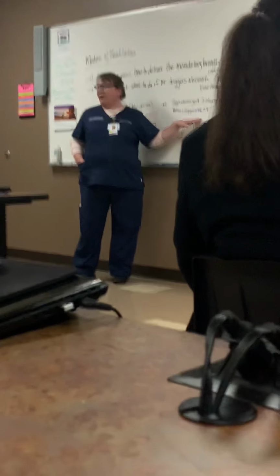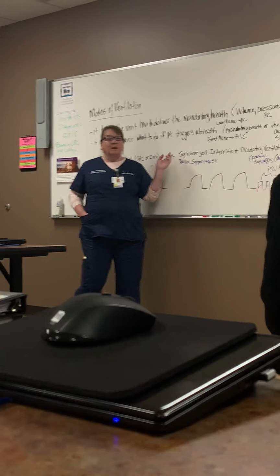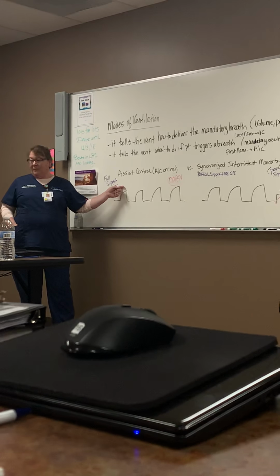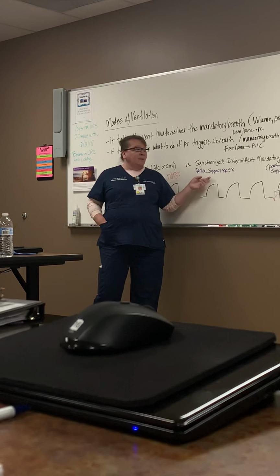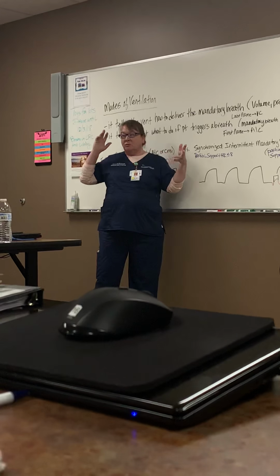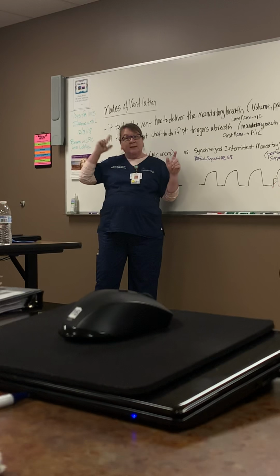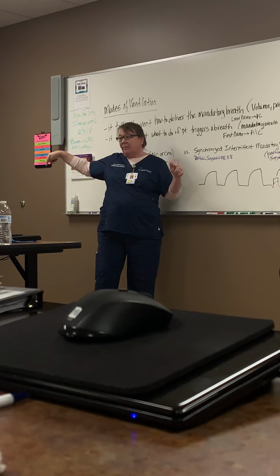We're really moving away from SIMV, and there's a couple reasons. Number one, we have found that we can go right from assist control to weaning, believe it or not. And number two, SIMV is actually not comfortable for the patient because the patient is always trying to trigger with the ventilator, or like time their breath with the ventilator breath.